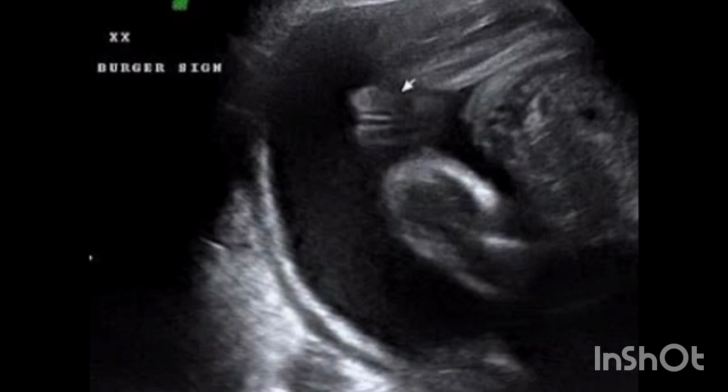These landmarks make it easier to tell what you are looking at, particularly when it is a photo and not a video. It's a girl for sure. That's what the ultrasound technician said at the look of this 20-week ultrasound. This baby helped make the diagnosis of girl a bit easier with the space between her legs.